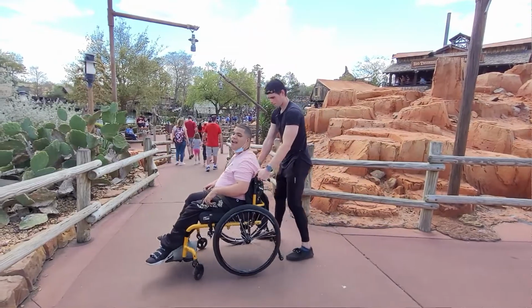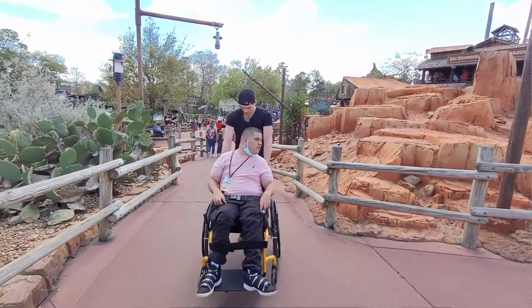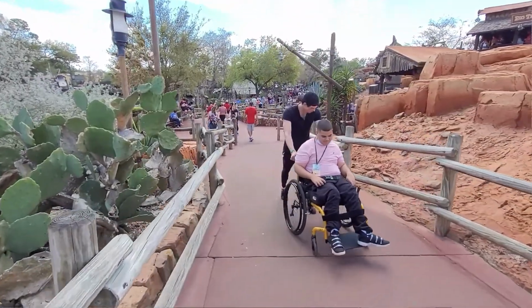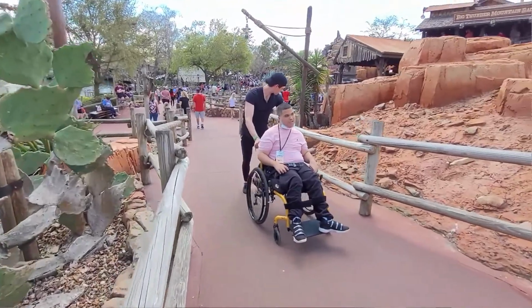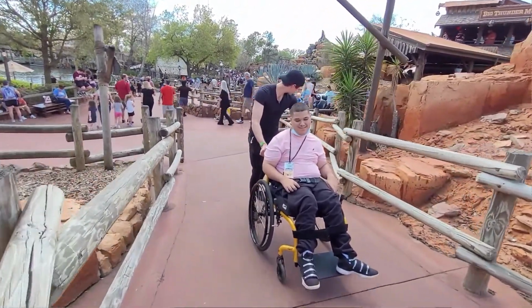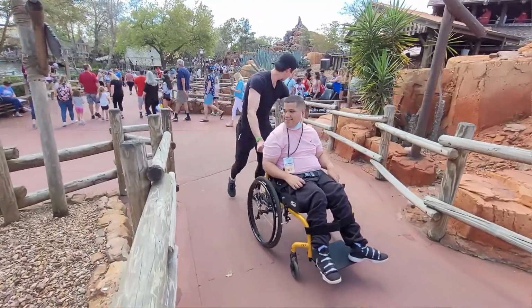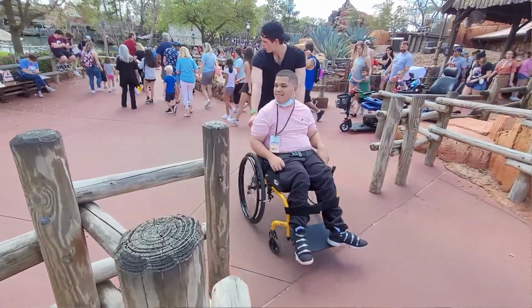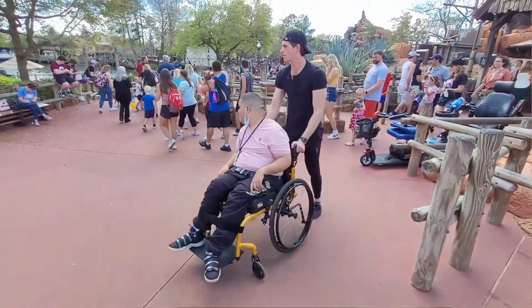So what you're going to want to do in order to make sure that you're going down a hill safe is actually turn the wheelchair around. Might be helpful to have someone spotting you so you can have eyes in the back of your head, but if not, you just take an occasional look behind you. And I actually want you to back down the hill. This will give you a better hold and control of the wheelchair so that we're not trying to pull back on that wheelchair and trying to stop it as we're going down and potentially losing control of that wheelchair.